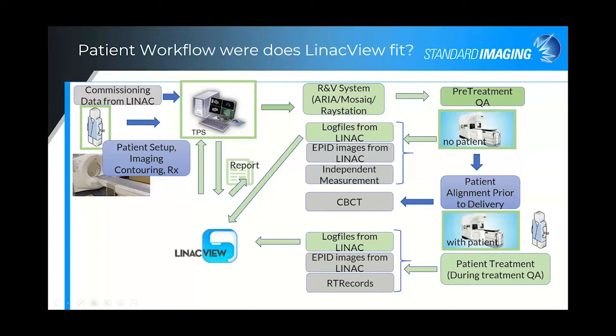So you can get some specific dosimetric information back through this workflow. So you can see it goes through a large portion of the treatment workflow.